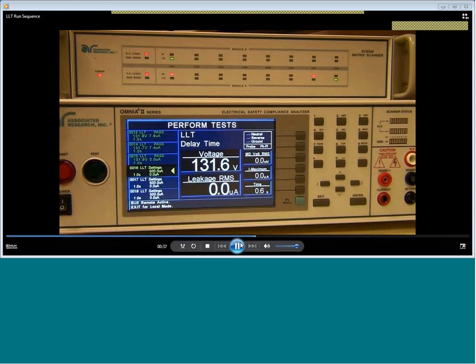So right there, you can see, first of all, that my scanner channel lit up. Now remember, if you look on the bottom right-hand side of the scanner, that's channels, what we would say 15 and 16, on the very bottom right-hand side there. So 15 is lit up red, and right to the right of it, 16 is lit up green. So I've set channel 15 high, channel 16 low.